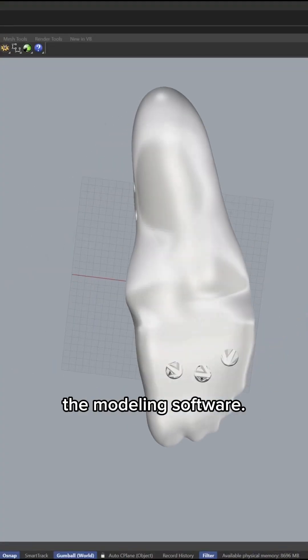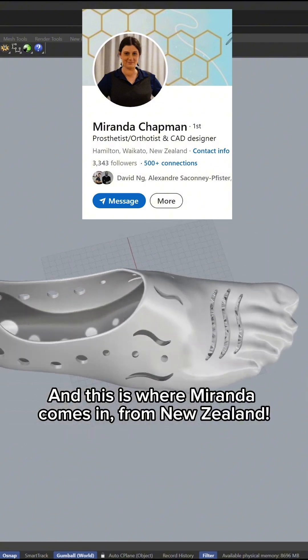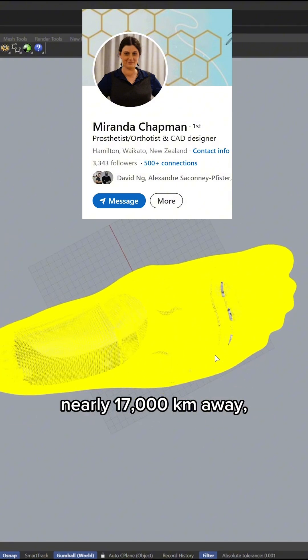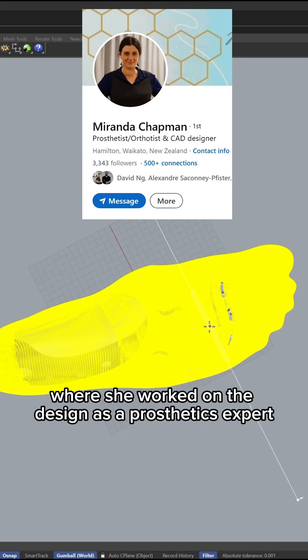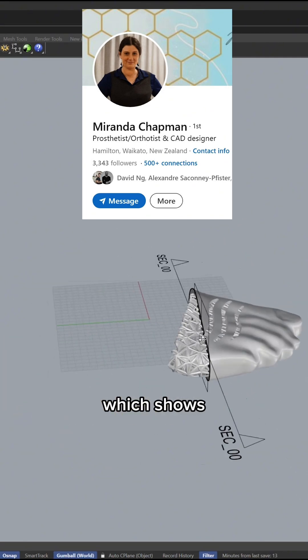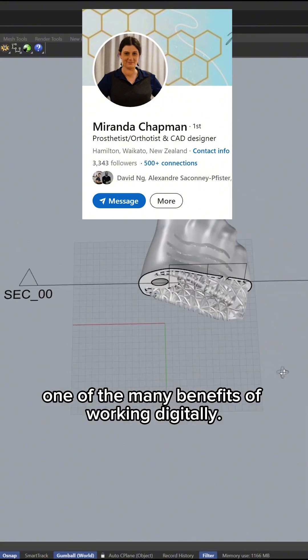Next we moved into Rhino, the modeling software, and this is where Miranda comes in from New Zealand. I captured a scan in Berlin and sent it to her nearly 17,000 kilometers away, where she worked on the design as a prosthetics expert without ever meeting Sydney in person — which shows one of the many benefits of working digitally.